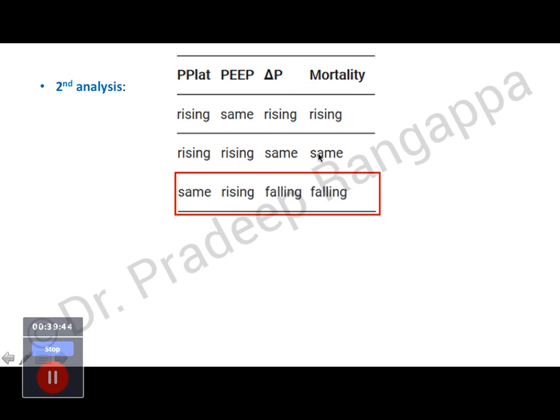So these two may not be beneficial. But if I have a patient, basically your whole driving pressure is to help understand which patients will survive, which patients will not survive, or which patients will remain as a plateau without improving or getting better.